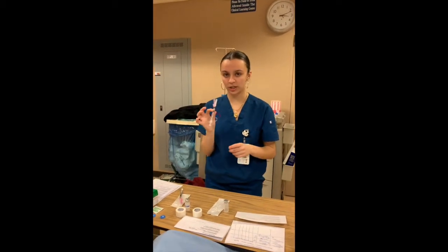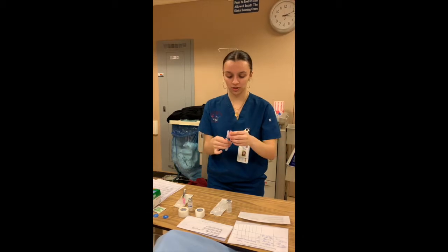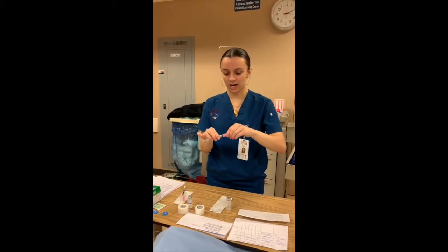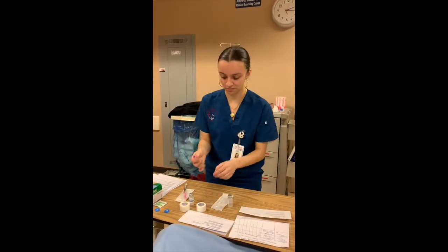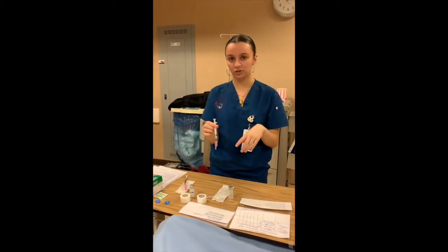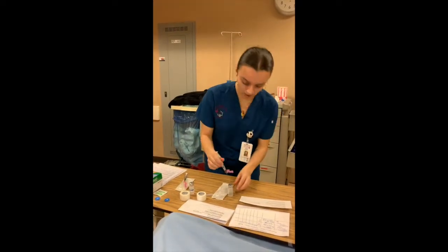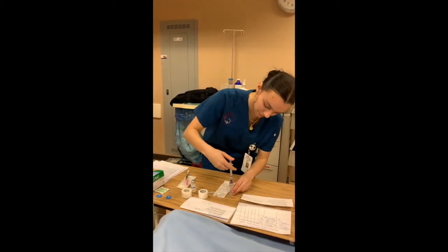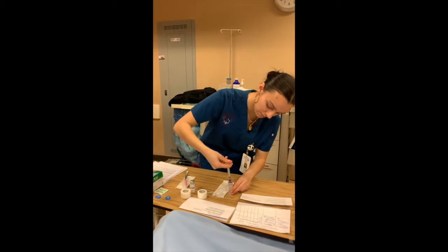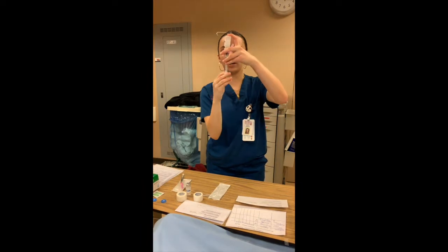Okay, so I'm going to be doing the intramuscular medication first. So I'm just going to take the cap off, like so. And then I'm just going to insert the 0.5 milliliters of air first. After I insert the air, I'm going to draw the 1 milliliter of medication for the heparin. Okay, so I'm just going to stick it in. I'm going to insert the air. And after inserting the air, I'm just going to flip it and then start drawing out the medication.